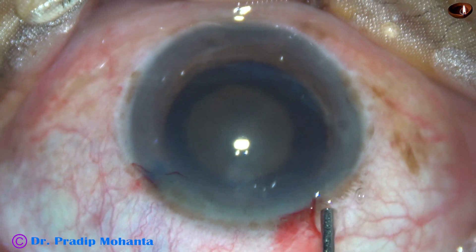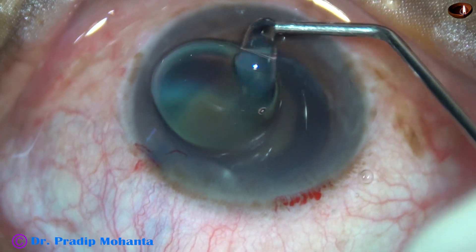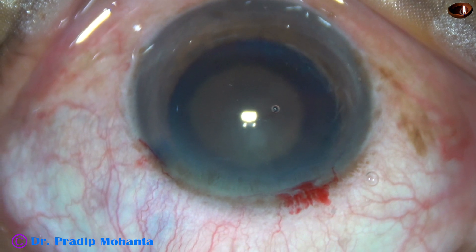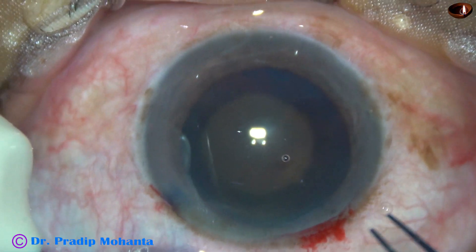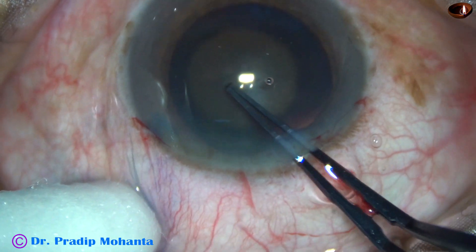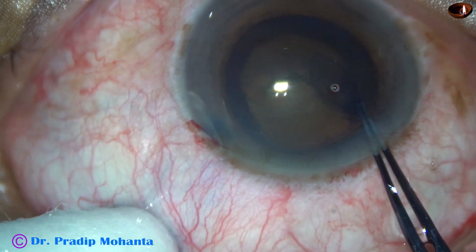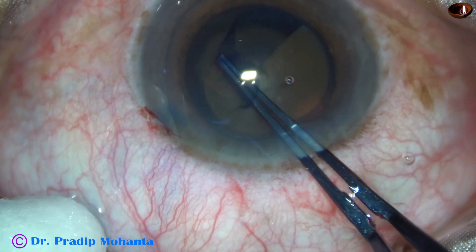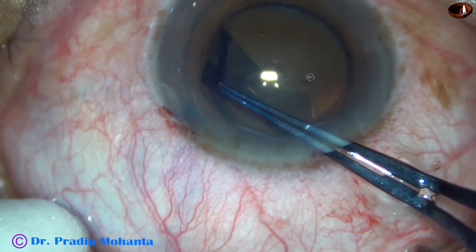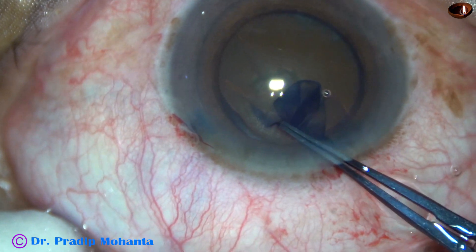But it didn't happen like that. We are going to see in a short while that the pupil will get small as soon as we start chopping the nucleus. Some amount of visco is applied over the cornea, and the AC has been filled up with HPMC. This is an utrata forceps. A capsular tag has been raised, and the capsular tag is guided just close to the pupillary margin to get an adequate size of rhexis.